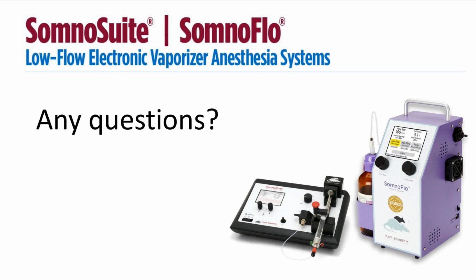And so the first of the 3 polls is, what physiological parameters do you currently monitor during your surgeries? So there's a bunch of options here: heart rate, pulse oximetry, blood pressure, ECG, temperature, and end tidal CO2. So please take a moment to answer that question.